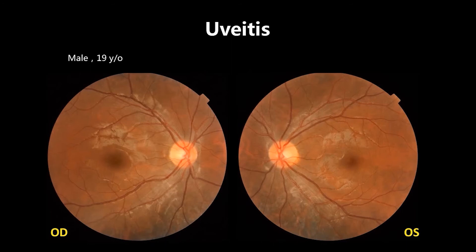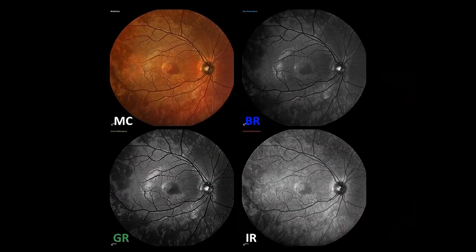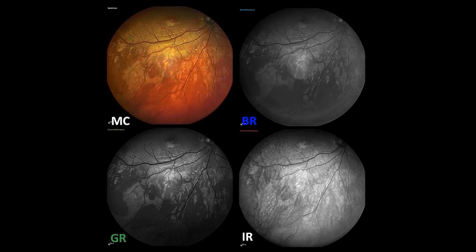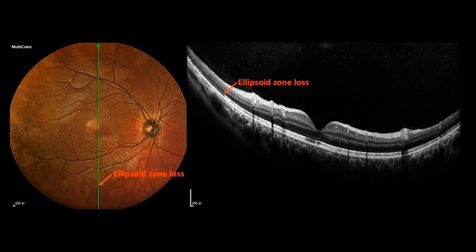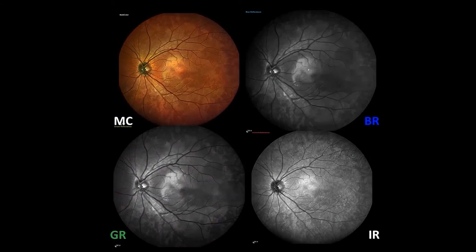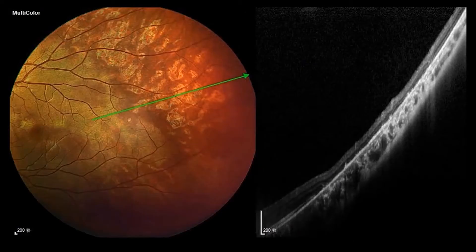This patient has uveitis on both eyes. On color fundus photo, we can only see some abnormal RPE changes in the lower part of the disc. But when we perform 50-degree multicolor imaging, we notice obvious changes of RPE in the mid-peripheral retina on blue, green, and infrared reflectance, as well as multicolor on the right eye. The OCT B-scan across the dark red area on multicolor image showed loss of the ellipsoid zone. The same changes are present on the left eye, and even more obvious in the periphery.